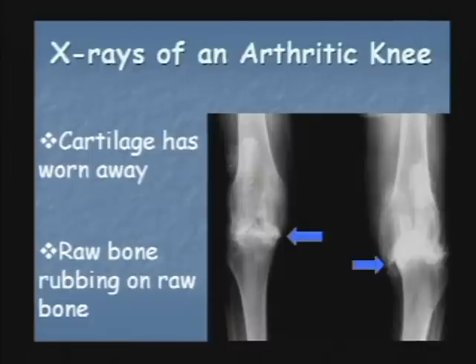We prefer these x-rays be taken standing with the knee slightly bent, so the knees are shown in a weight-bearing position as they normally would be while you are walking or standing. This allows the physician to determine the amount of cartilage remaining between the bones.